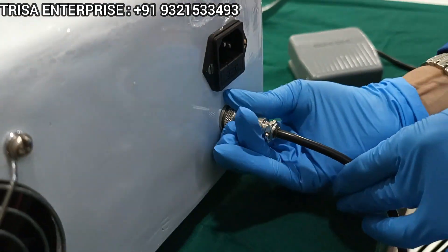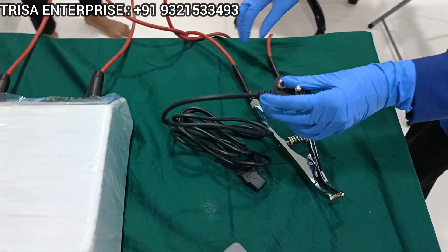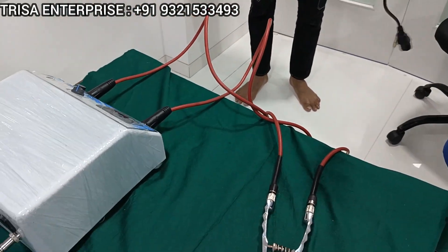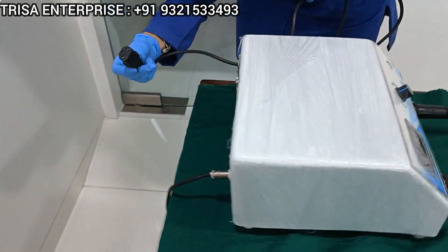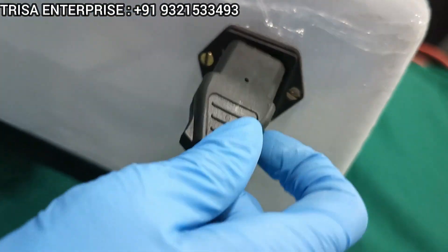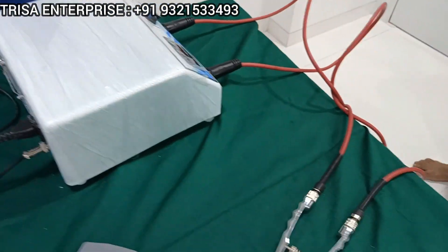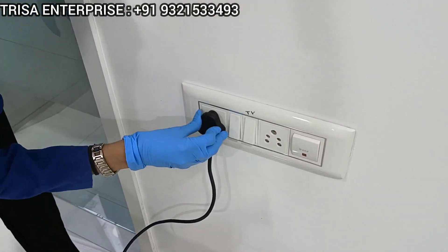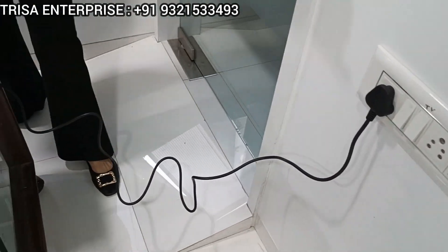Now this welding machine is all set and all we need to do is connect the power. Make sure that wherever you are inserting this three-pin plug, there is a safety earthing given — it's very important. Connect the back side of the plug to the machine, match it with the three pins, and connect the three-pin plug to any socket which has proper earthing. Now your machine is ready with power.